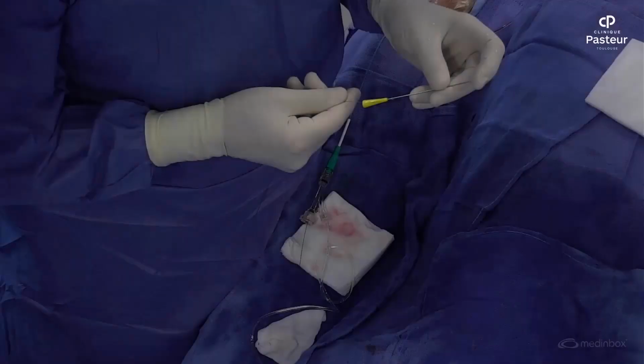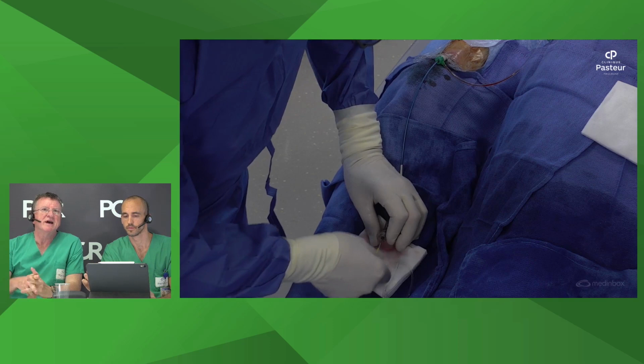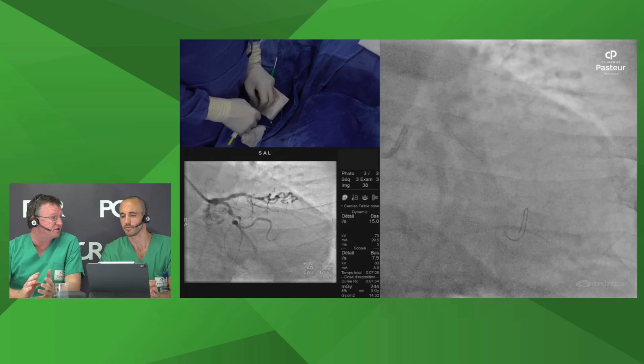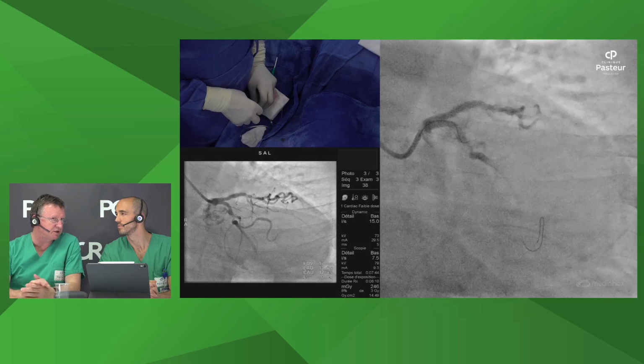The stent companies make claims about the deliverability of the different systems, and operators form opinions. How much true science is behind that, and how much is perception and an emotional reaction rather than reality is hard to say. I'm not really convinced that any specific stent is more deliverable than any other one at this point in time, given the current generation of systems. Many people will argue differently, and they will have their favorites, but I don't think that the actual stent manufacturer is a big driver of deliverability. They're all very deliverable, in my opinion.